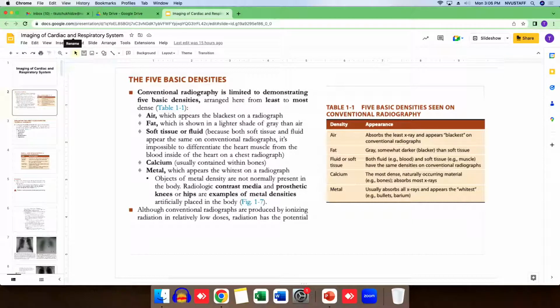If we're having some kind of calcium, for example the bones, or some kind of dense calcific tissue, it usually appears more whitish, and we will see several photos of that. If we're having some kind of metals, meaning some patient might have a catheter or some kind of technical devices on the heart, it appears also a bit whitish, and we can identify the structure.